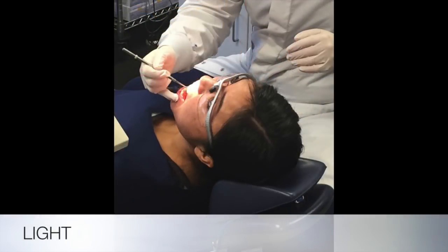L is for lighting. It is important to use your overhead light and mirror for maximum illumination. Oftentimes, myself included, when hygienists move from one quadrant to the next, the light isn't adjusted in a way to provide maximum illumination. And essentially, when we do this, we are cleaning in the dark.